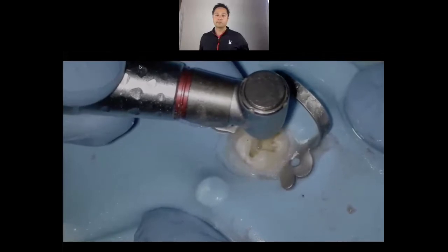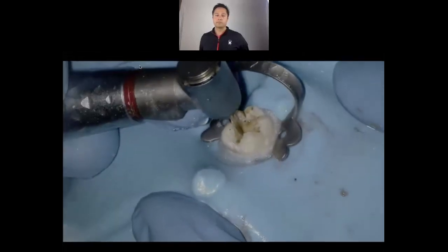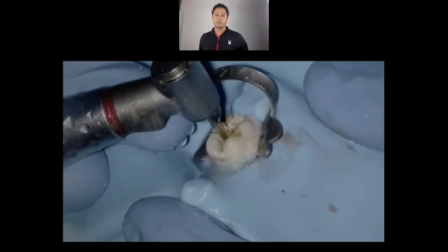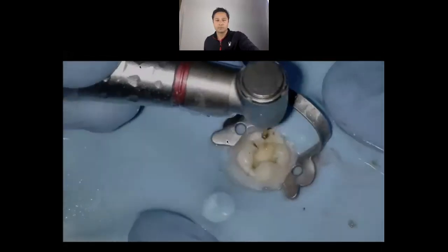The beauty of using the high-speed electric — this is our BN Air. The BN Air rep told me: if you can't remember, blue is for slow speed and red is for danger, high speed. What I do routinely on almost every endo — if I haven't gone into the pulp chamber — I'm going to be looking to see where the shank of that bur changes in direction, diameter, or shape. You've got where it goes from the shank down to the tip of the bur, and that's six millimeters long.